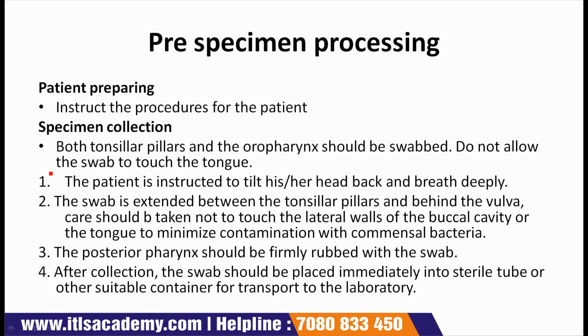Points regarding specimen collection is: first point, the patient is instructed to tilt his or her head back and breathe deeply. The tongue is gently depressed with a tongue blade to visualize the tonsillar fossa and posterior pharynx.